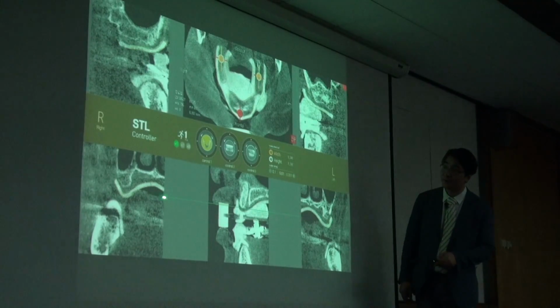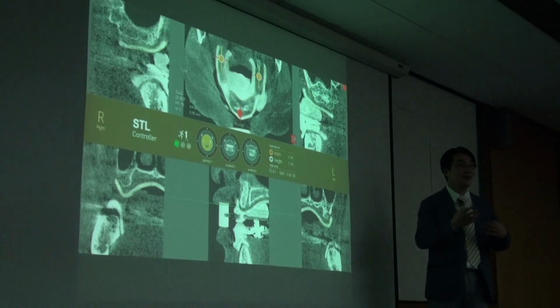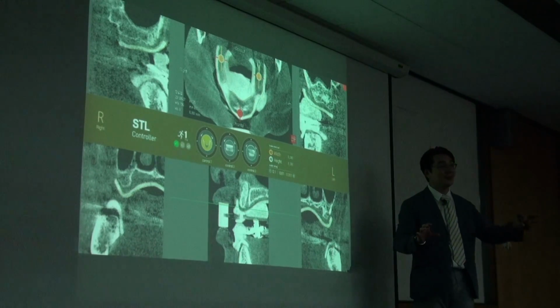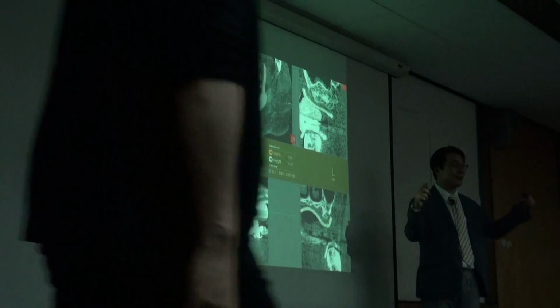This white object is the fully radiopaque thread. I scanned the inside and outside of the thread and matched the total. So if CBCT is accurate and the STL file is accurate, after merging, it shows this perfect matching condition.